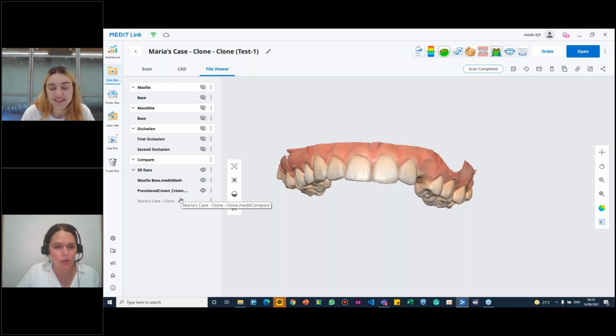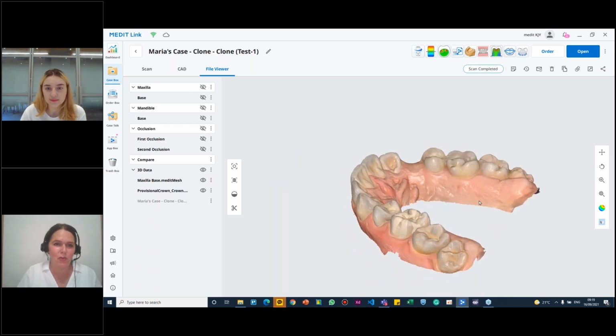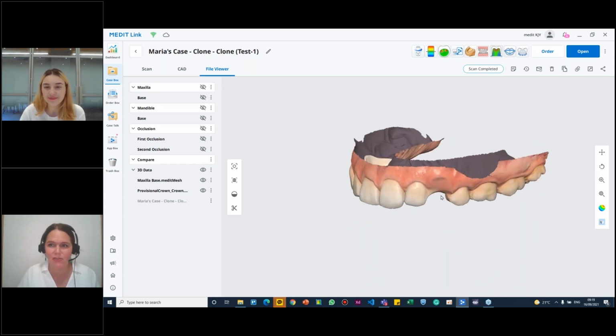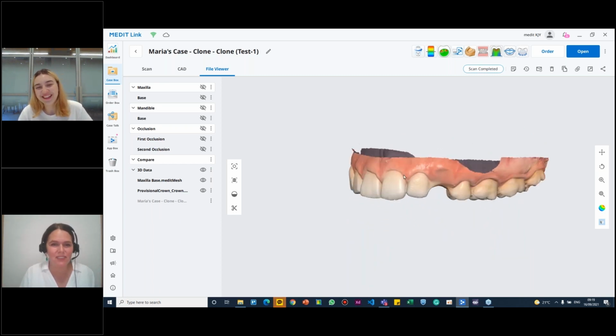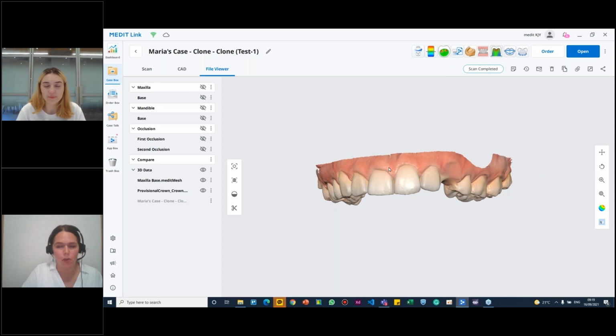Perfect. It was kind of a quick one. And again, those of you who wanted to learn more about really how Medit Compare works, we have a webinar for that, where Maria spent a little bit more time going through the step-by-step process. This is just about the new features in Medit Compare. I think eventually someday we'll probably do a full Medit Compare, but you guys update everything so much there, Maria. We'll be doing webinars forever with all your updated apps coming out. So anyways, we'll get eventually something updated. So please email me, as I said, if you would like to see the original webinar.